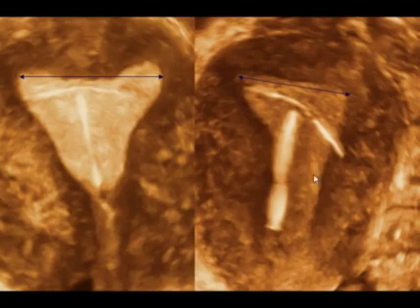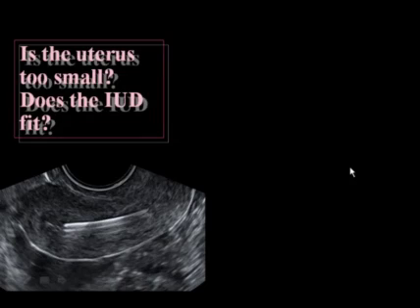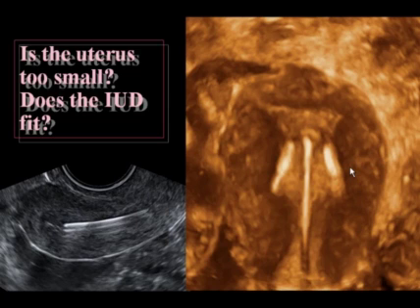Now here is the width of the uterine cavity transverse in a patient with a normally placed IUD versus one where the cavity was narrow and the IUD was not normally located. Now, the question is, is the uterus too small and does the IUD fit? In this case, it doesn't. It never really got deployed.